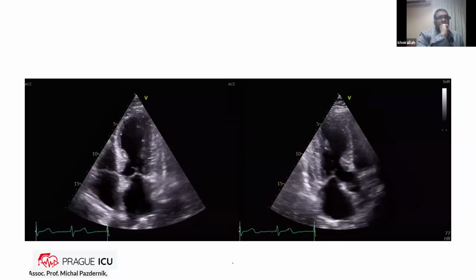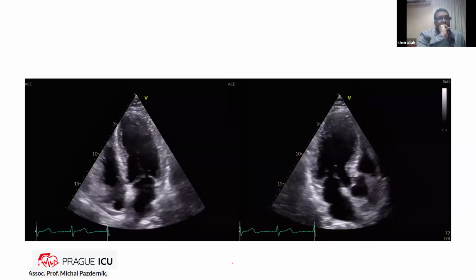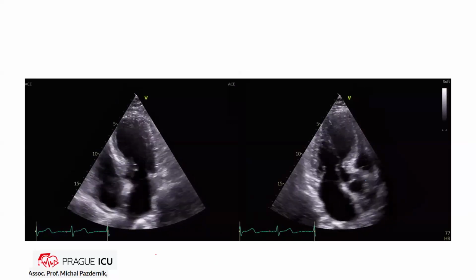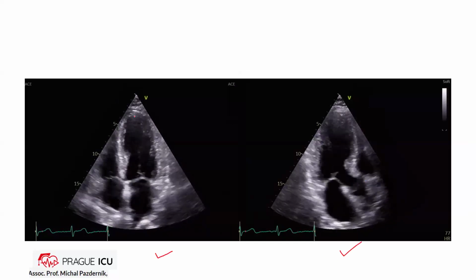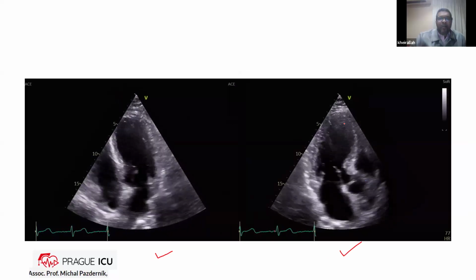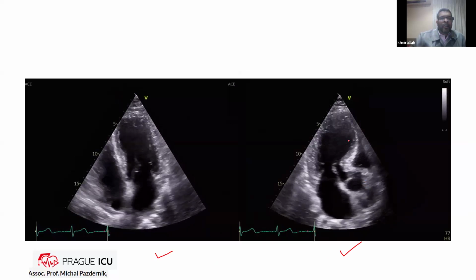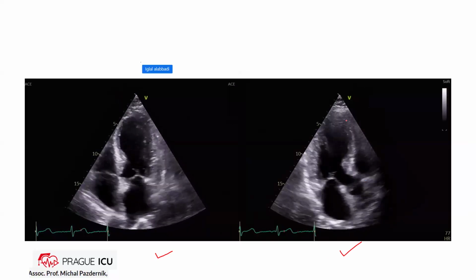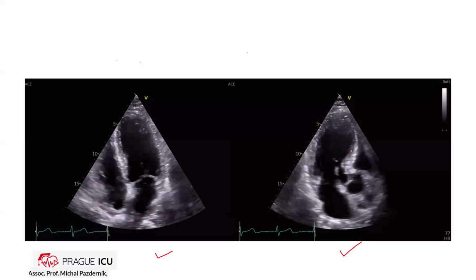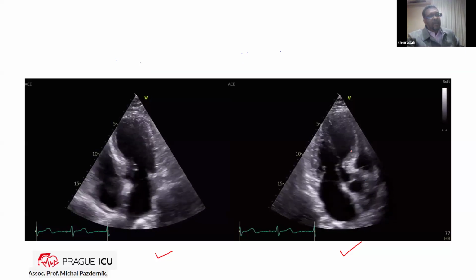What is this? This is apical. This akinetic apex. Okay, you can say that. Here the apex, yes. And also what else? The anterior wall, anterior septum. It's what? It is akinetic. It's not thickening at all, you see? Yeah. It's akinetic. So now we know how hypokinesis looks like, how akinesis looks like. Yes? Good?